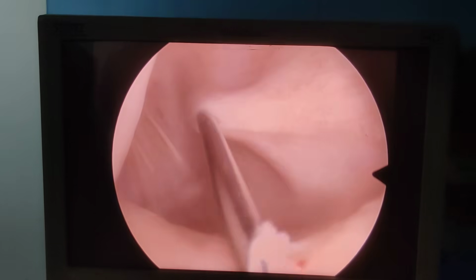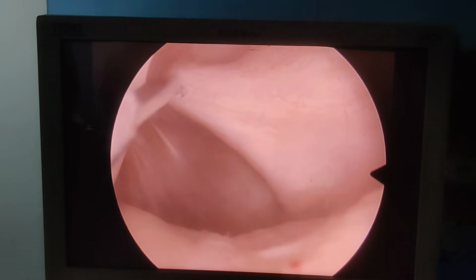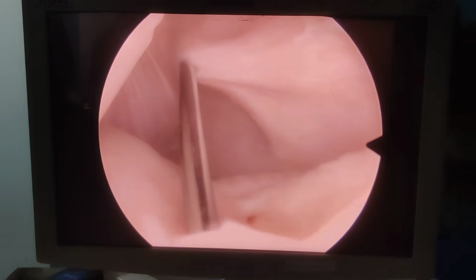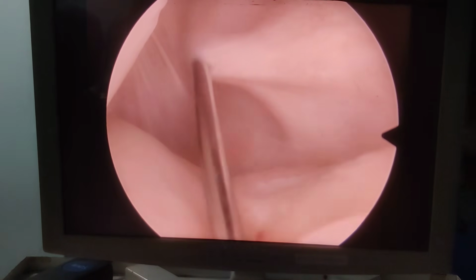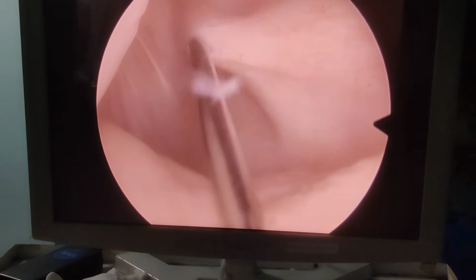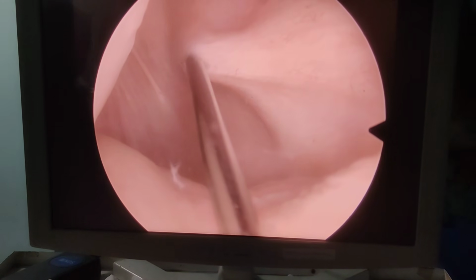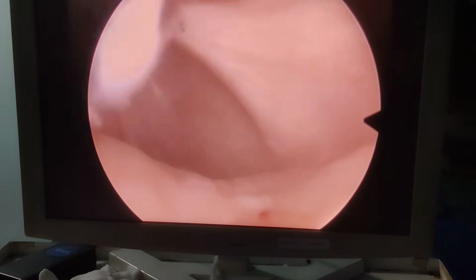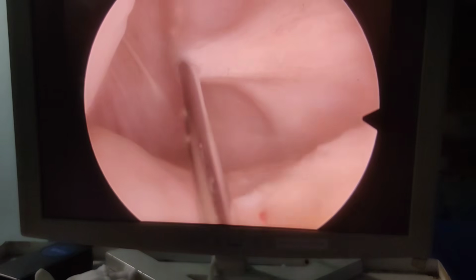So I am far away from the posterior condyle of the femur, because if I'm too anterior, then there is no way, because I need to work behind the tibia at the origin of the PCL, which is here. So you need to have an access. So use a needle to make sure that you have got good access in the back when you want to debride it. So this is how you make your posterior medial portal. So stay away from femur, and then stay away from the back of the tibia, this is the back of the femur, so that I have good access. So now you can see I've got good access.